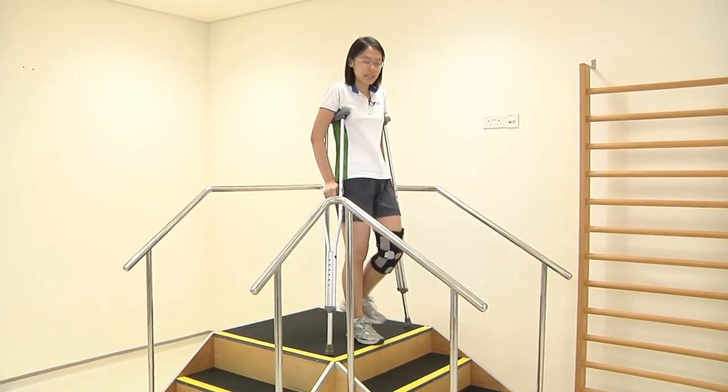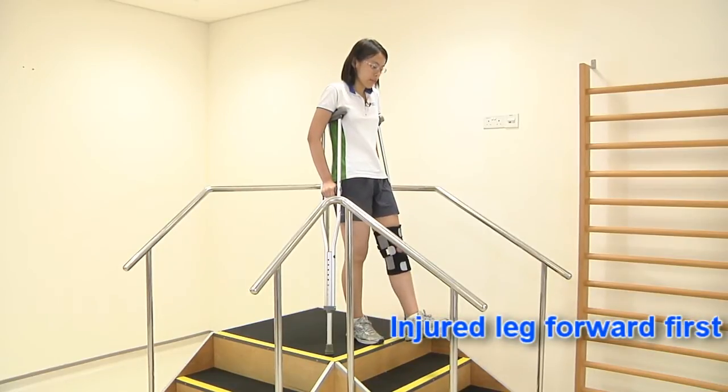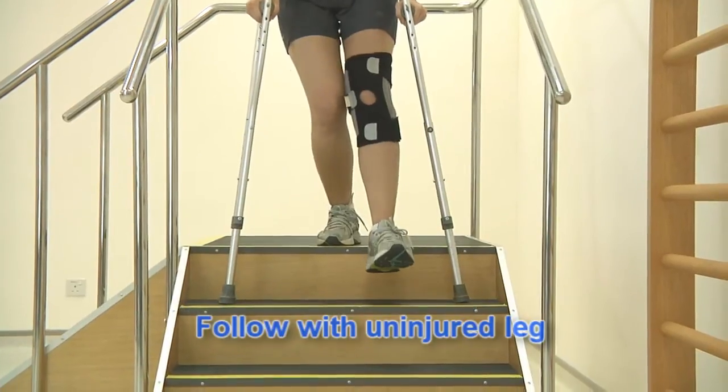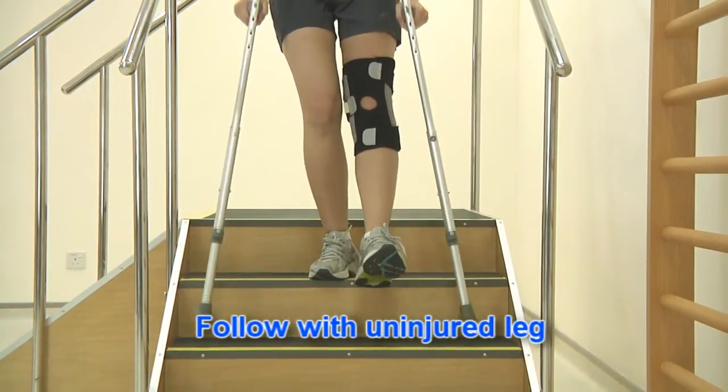To move down the stairs, bring your injured leg forward. Place your crutch down on the step, then step down with the good leg.